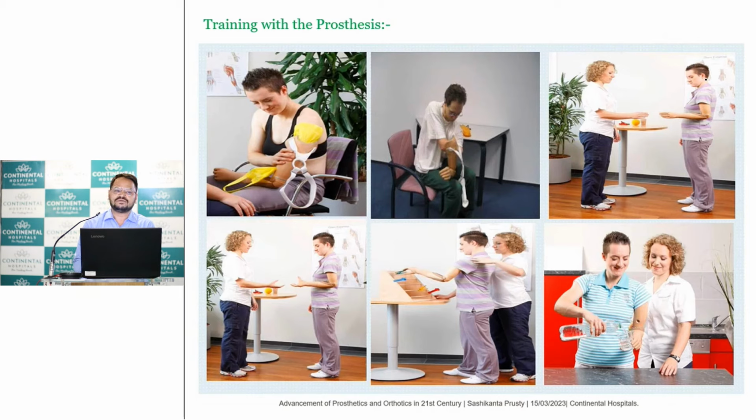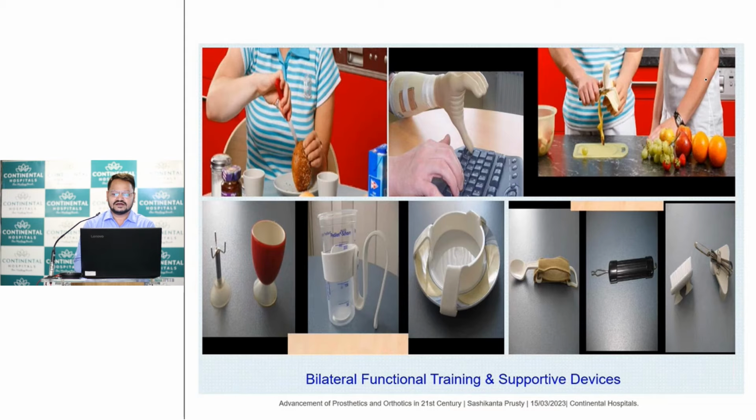Sometimes they may not be able to hold a spoon properly, and we have to modify it slightly, or they may not be able to comb their hair, so we have to plan some stand, some bigger stand. So these are some of the things, as per the patient's need, that we can plan. And we also have software-based options, that can be a mobile app. In that we can add whatever their activities are, and whenever they want those activities, it will work on that.